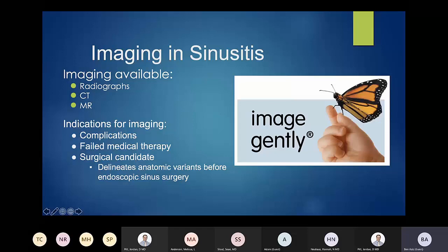Radiographs themselves are not very accurate. You can't see a whole lot on radiographs — you may see significant opacification of the sinuses or air-fluid levels. The maxillary and frontal sinuses are generally easier to see, but it's very difficult to catch significant changes in the ethmoid or sphenoid sinuses on a frontal view. On a lateral view, you can catch some opacification and air-fluid levels in the sphenoid sinus.